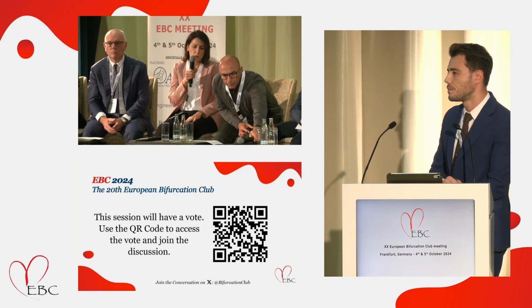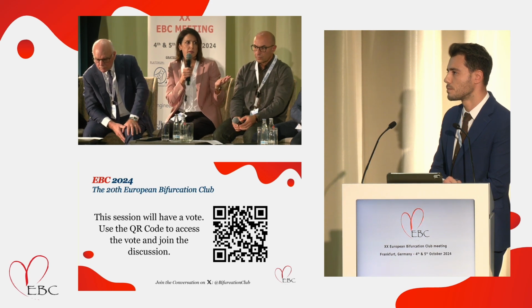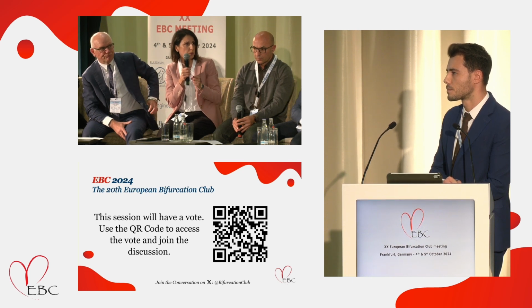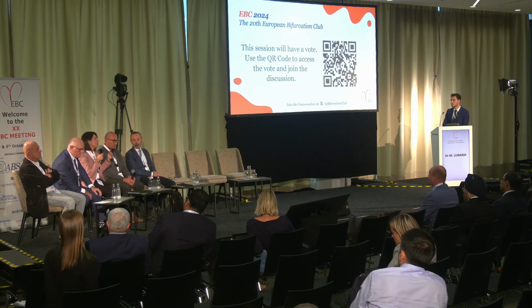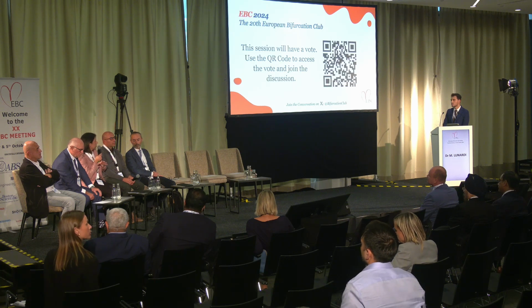Okay, because I wanted to stress that it is different. There is a difference regarding the left main bifurcation with pot side pot and any other bifurcation. Because the side branch is usually smaller than the circumflex, and then the deformation or the malposition probably is going to be smaller in other non-left main bifurcation lesions.